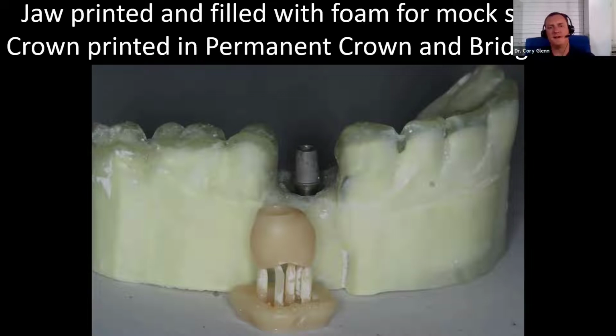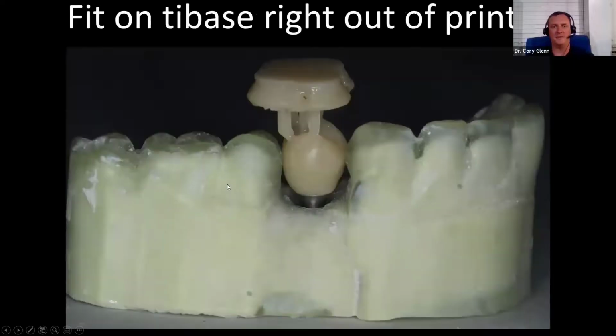Now, this is the first time we'd ever tried something like this, so I thought it'd be wise to go ahead and try it on models first in theory and make sure it all worked. So this is just a model filled with foam that I could drill on. I did the guided surgery on it. I placed the implant. Now I'm putting on that tie base. And in theory, if all of this worked right, then this printed crown, which I've not even tried on yet, should drop right onto that with ideal contacts, ideal occlusion, all of that.